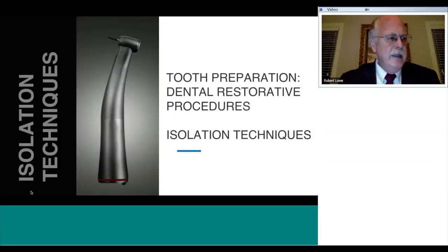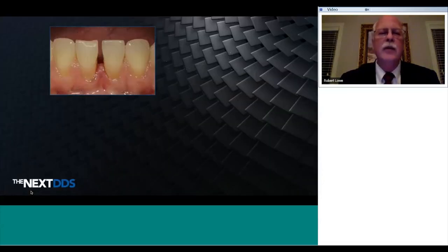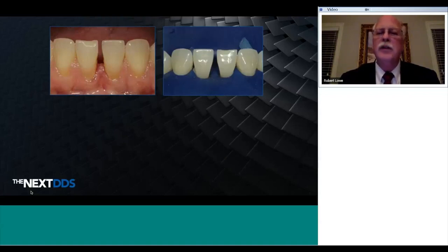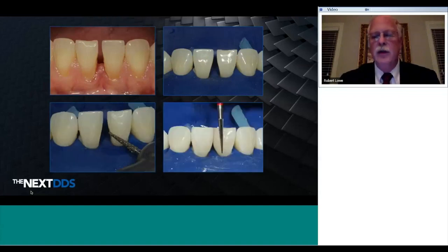First of all, mentioning isolation techniques. In dental school, we are quote unquote drilled upon isolation with the rubber dam. Here's an operative case where we're going to do a diastema closure and an adhesive procedure, which means we need to have isolation from the oral environment, from possible contaminants of blood and saliva, so that we can have an optimal restorative result using a resinous-based material. So rubber dam has always been a standard which we could use as isolation to keep the patient's tongue and cheeks and saliva and fluids out of the way and keep the operative area relatively available for us to do our best operative and fixed dentistry.